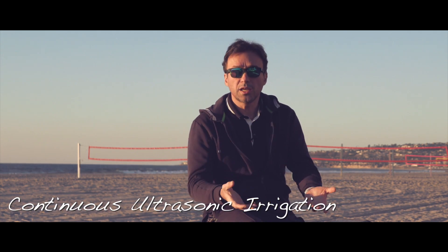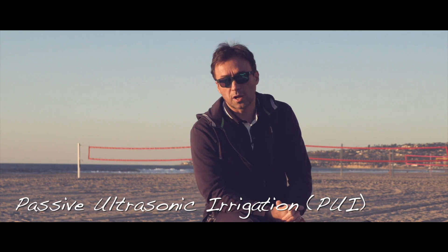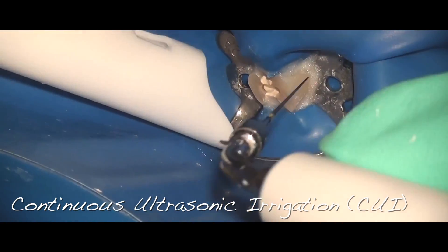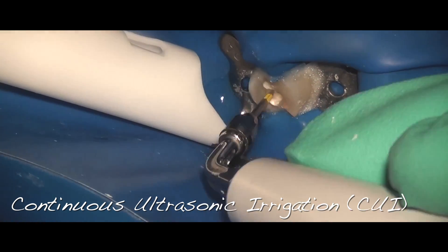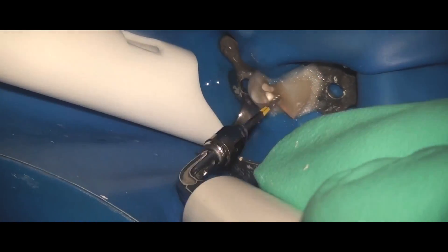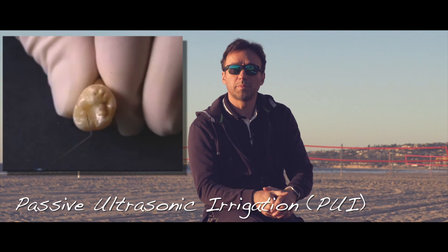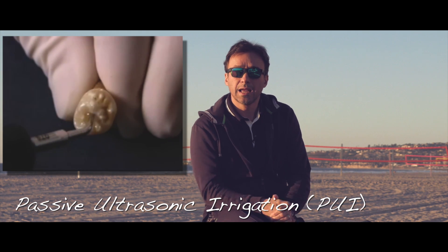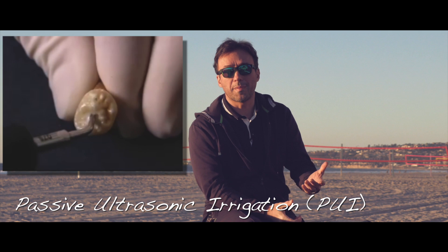It could be done in terms of continuous activation versus passive ultrasonic activation. The difference is that in one you're using an ultrasonic with a continuous flow of fresh material — whether it's water, hypochlorite, or whatever other irrigant you have — being continuously replenished as your ultrasonic re-activates it. In the other usage, you would be putting some hypochlorite in the canal and then activating that solution with the ultrasonic for a given amount of time.